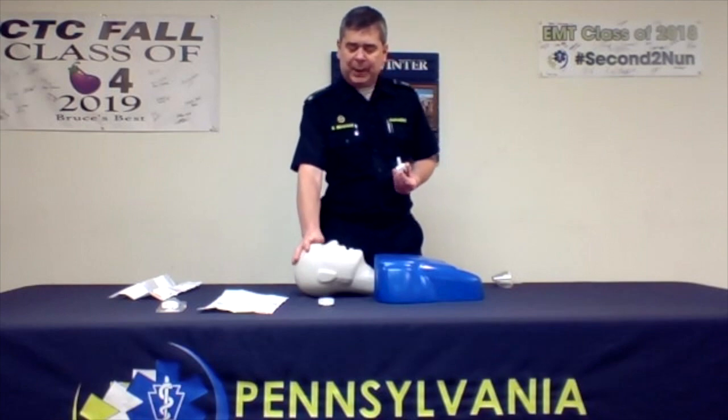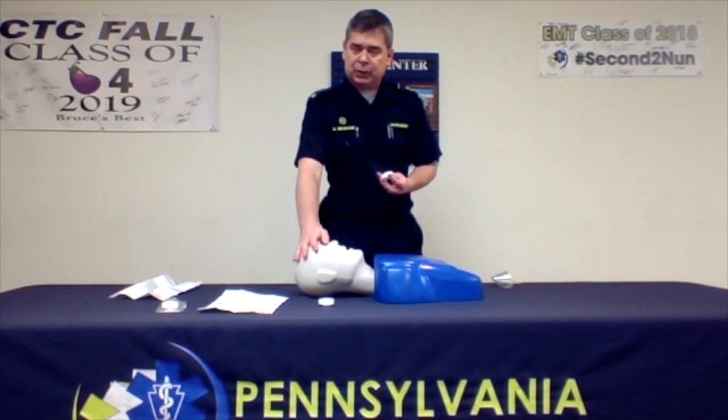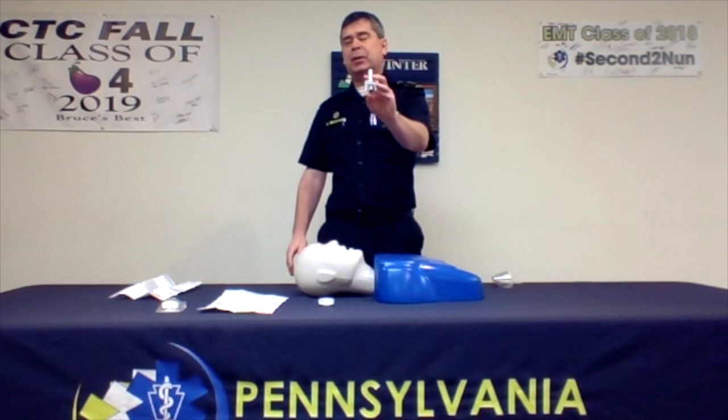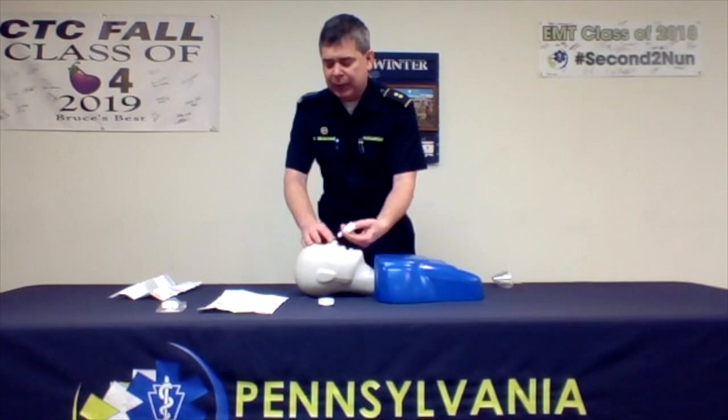Simply, with the patient that we've identified that requires this Narcan, we're going to push the nose back. We want to hold the Narcan nasal cartridge in our hands with our thumb on the button. Place the nasal Narcan cartridge up into the nostril until your fingers meet up against the nose.